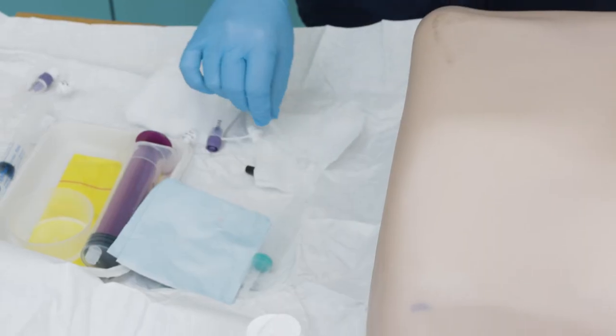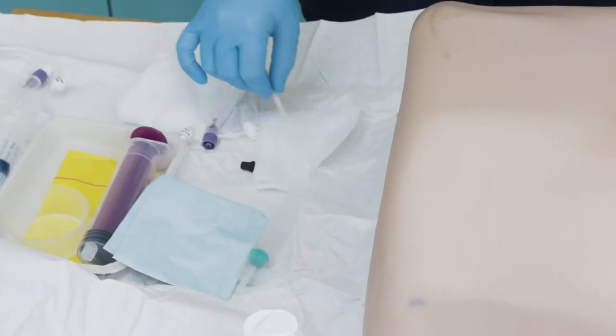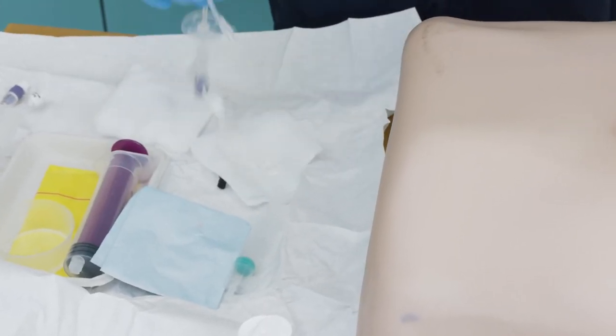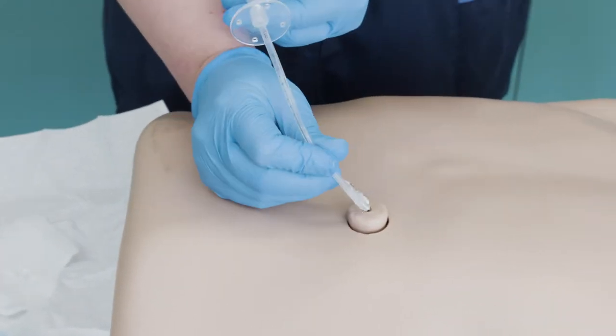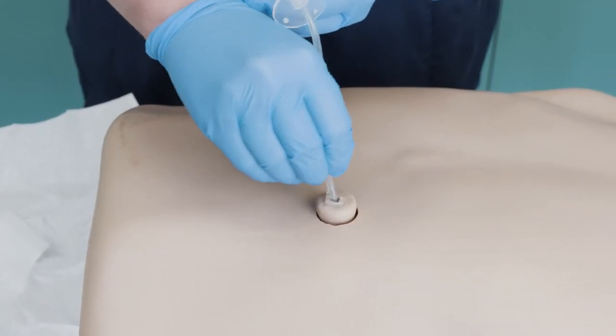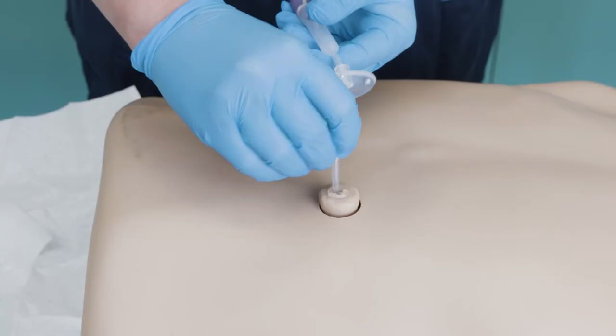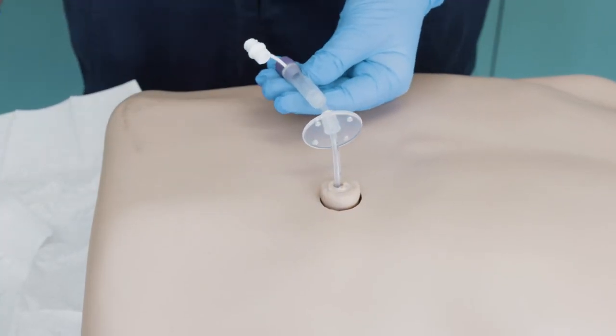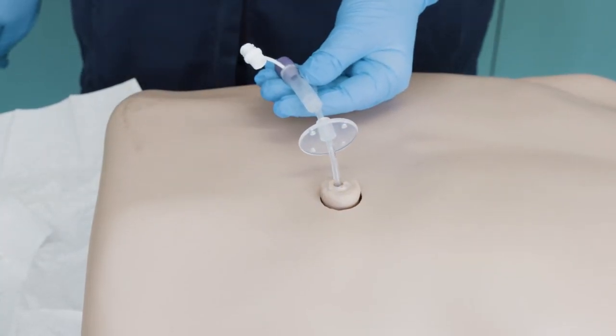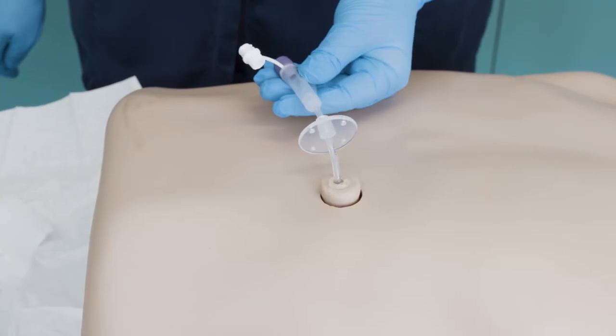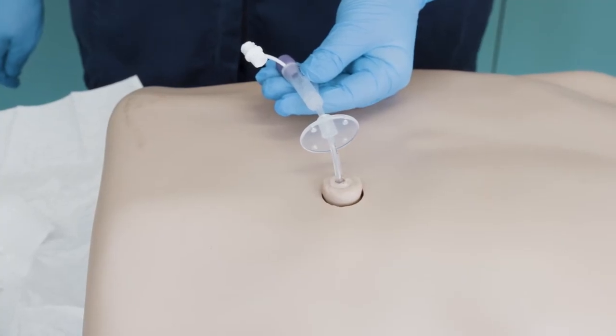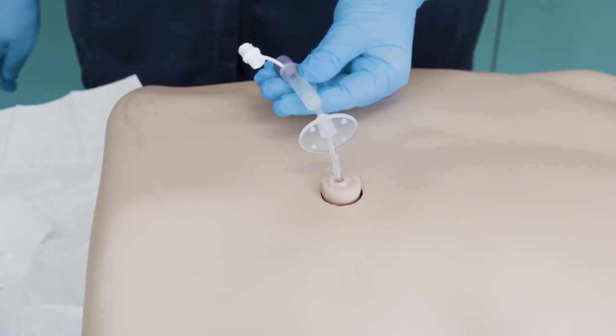Lubricate the end of the new tube with a small amount of lubricating jelly and insert the tube into the stoma site. Please note: if any unexpected resistance is felt or patient experiences acute pain, then please stop the procedure and contact the enteral nutrition nurse team or children's community nursing team for advice.